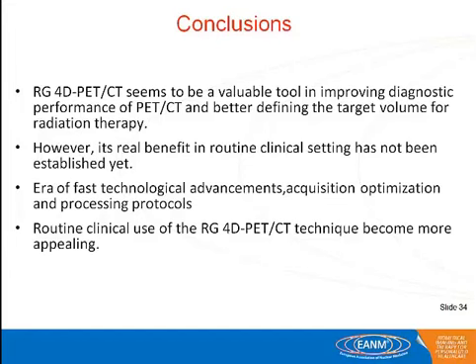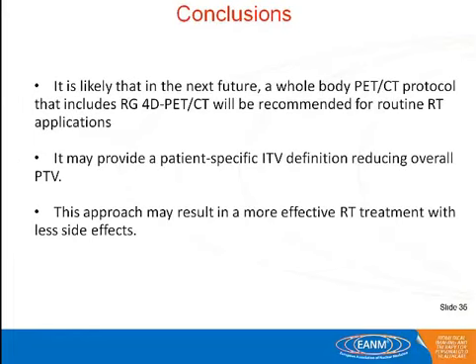And so we really feel that, with the continual stress on tailoring treatments to patients, the routine clinical use of respiratory gating for PET/CT will be appealing for the years to come. We hope that in the future it will be routine, because it can really provide a specific internal volume definition, reducing the overall planning target volume.